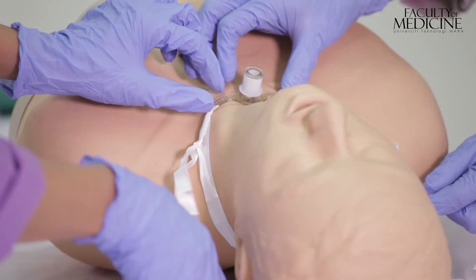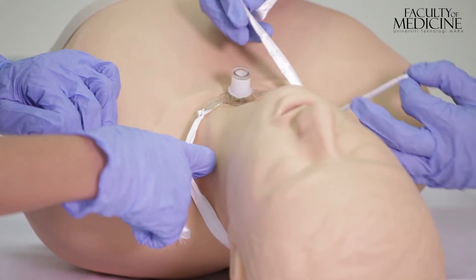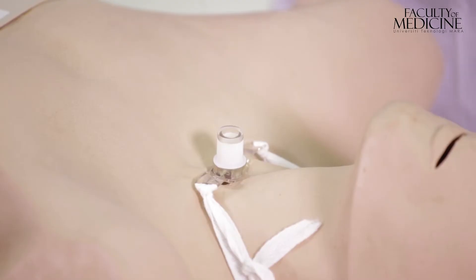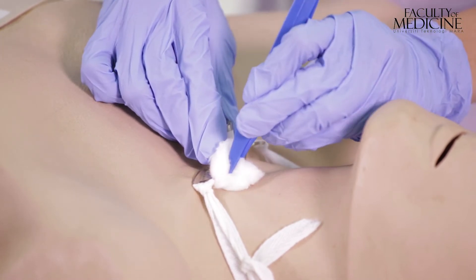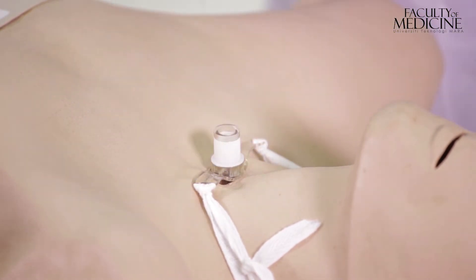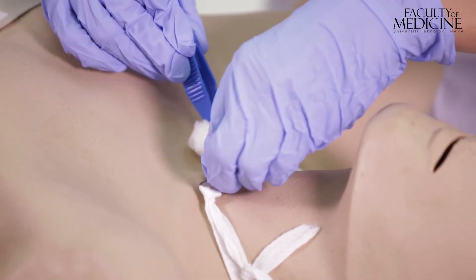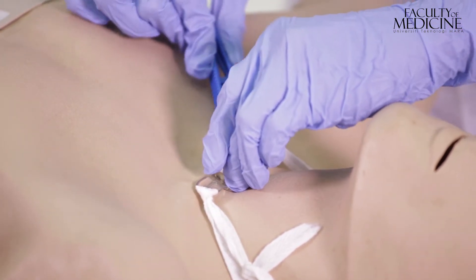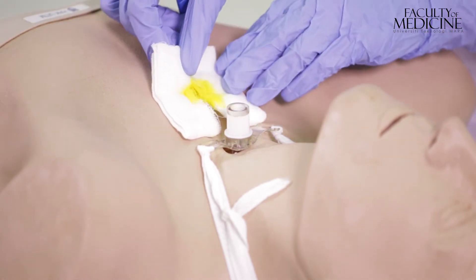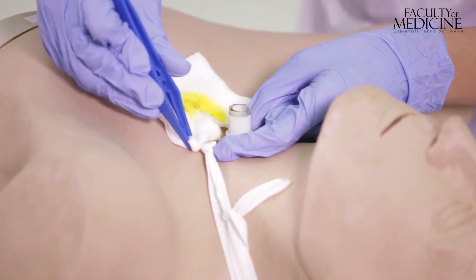This is repeated on the assistant's side. The tracheostoma is cleaned using normal saline soaked cotton wool. Be careful to gently manipulate the tracheostomy and its flanges to avoid dislodgement. To complete the dressing of the tracheostomy, a keyhole dressing is inserted using a forceps. This may be instilled with a small amount of flavine to maintain antibacterial activity.